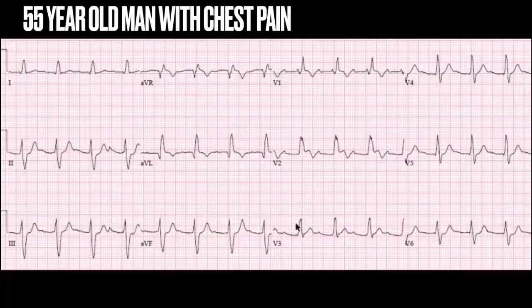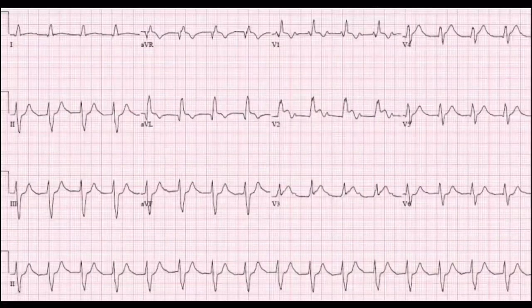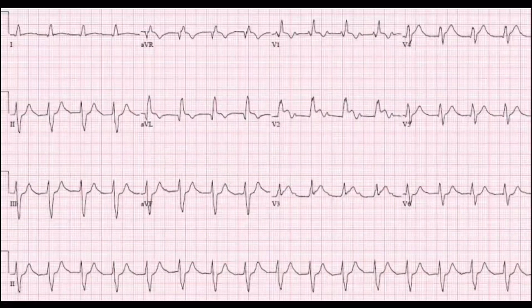This is the ECG of a 55-year-old man with chest pain. So what is your diagnosis? And this is another ECG — the ECG of the same patient after 30 minutes. Look carefully and tell me what is your diagnosis. Even though the first ECG looks like a normal pattern, careful examination might reveal important clues to diagnosis.